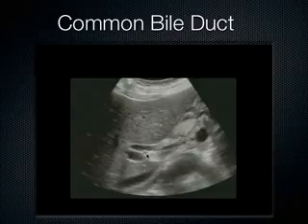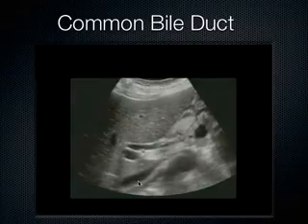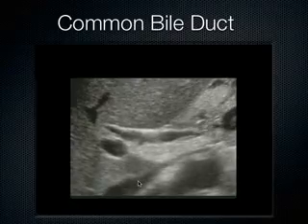And then we can see kind of staring back at us right through that little circle in the short axis, that's hepatic artery. So we're seeing this is the portal triad right here. It's just looking right back at us. Anybody want to take a stab what this is down here? Good, IVC, exactly.